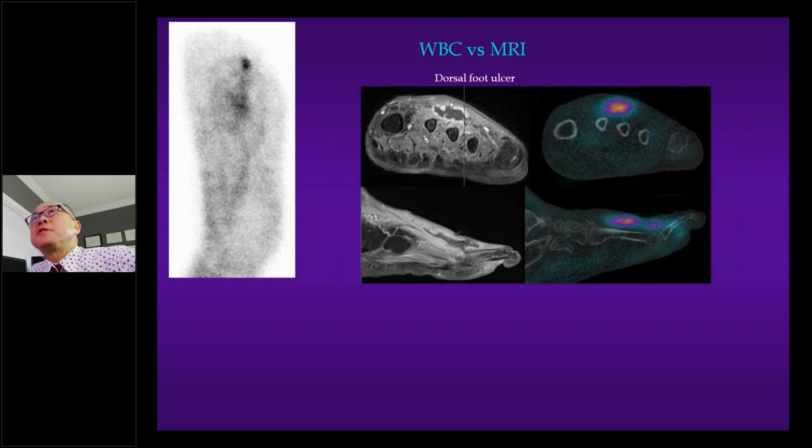We were asked to demonstrate the distribution of a patient with known soft tissue infection with a probable ulcer, and to document the full extent of the ulcer for pre-surgical planning. It's not difficult to see the distribution of abscess on MRI. Here it is, beautifully outlined by contrast, and also a little bit of gas within the abscess.